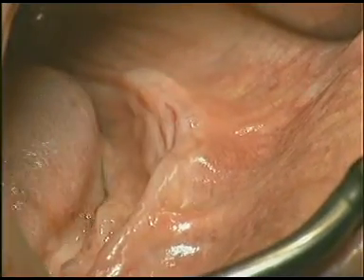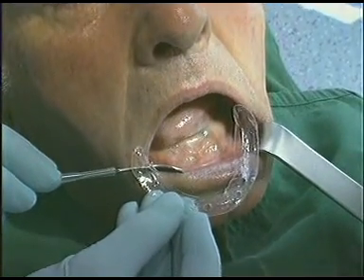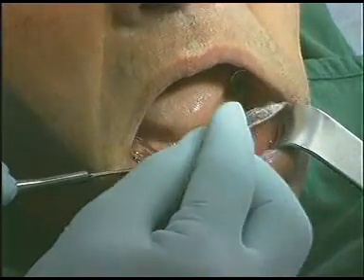If the implant axes have been established while analyzing the model, a template can be fabricated to facilitate alignment.